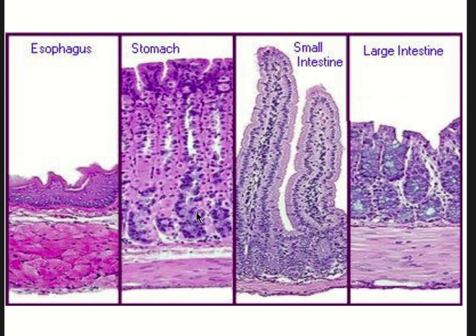They're kind of congregated at the bottom of these pits here, and they're kind of stained a little bit darker. Whereas here, you have these nodules, which are probably lymphatic tissue, and you're not going to see that just sort of secluded and contained at the bottom of these pits like you would the stomach. And the small intestine is very easy because you see this villus.